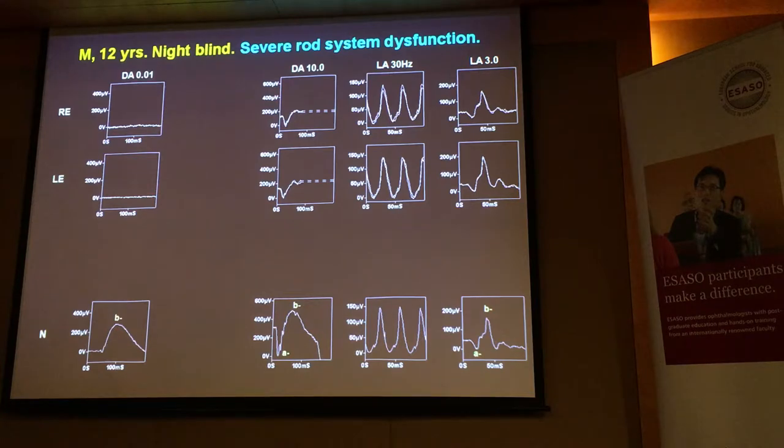Congenital stationary night blindness. As you'll see later on, this is not the kind of ERG you get in that disease, but it's a reasonable question. Anyone else want to have a stab? But you're thinking in terms of inherited disease. Okay, well, when you're looking at the ERGs, you have to identify the origins.